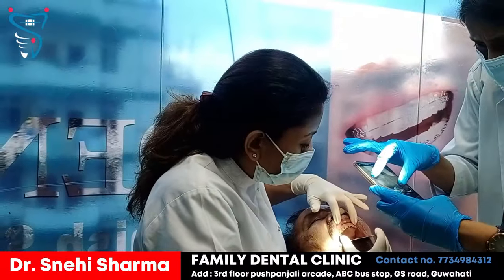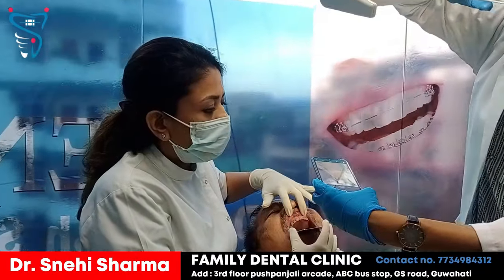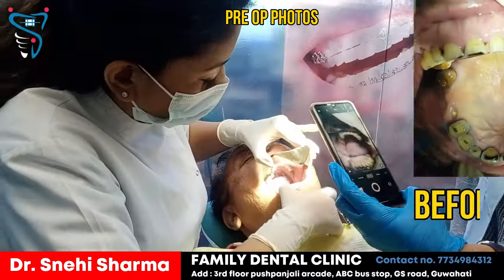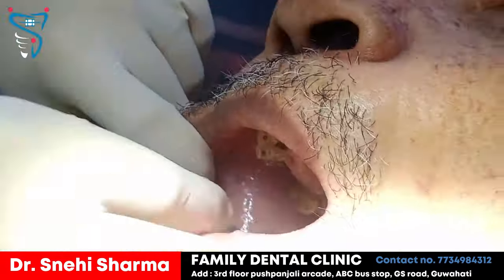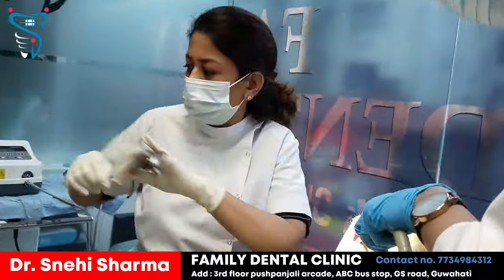We start by taking some internal photographs of the patients to show them their before and after — the upper arch as well as the lower arch. We'll wait a few minutes for the anesthetic to take effect.